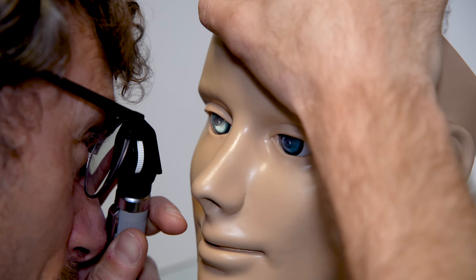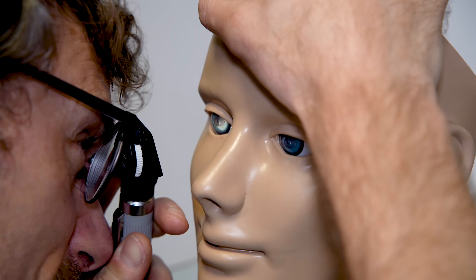Once we've looked at the optic disc, we want to make sure we're covering the four quadrants of the retina, very much in the same way as we assess the visual fields in our cranial nerve examination. We look at the areas of the retina by moving our ophthalmoscope around like a torch, checking all four quadrants and asking the patient to change their fields of view: top right, top left, bottom left, and bottom right.